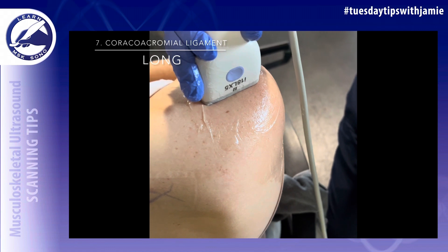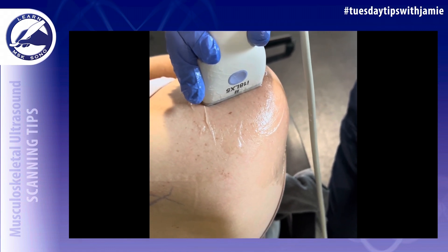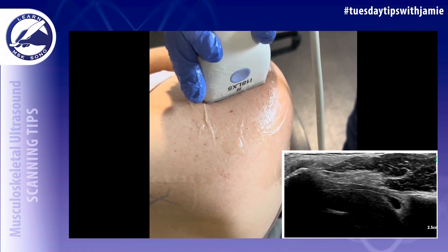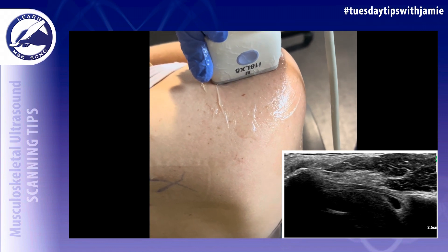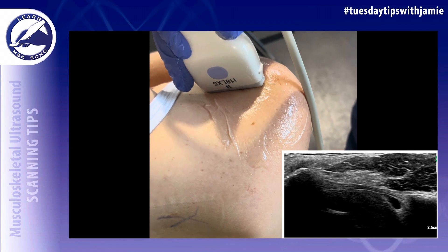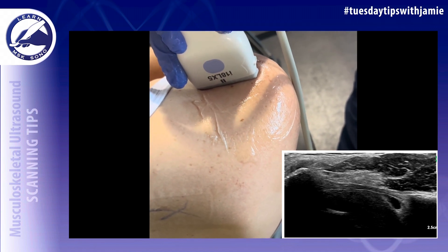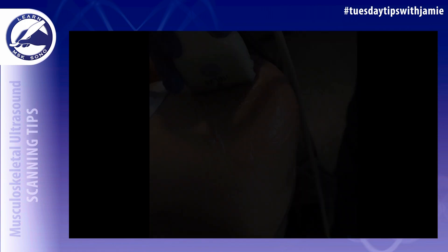Use the AC joint as a landmark to find the coracoacromial ligament. Keep the lateral part of the probe fixed on the acromion and rotate the medial part downward — in this case clockwise — until the coracoid process of the scapula comes into view. The coracoacromial ligament runs between the acromion and the coracoid process of the scapula.